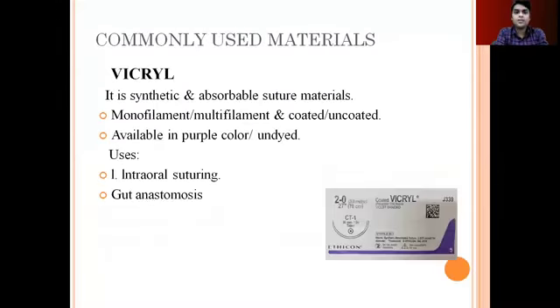Coming to Vicryl, it is synthetic and absorbable suture material. It may be monofilament or multifilament, and coated or uncoated. It is available in purple color or undyed form. It is used in intraoral suturing as well as gut anastomosis.